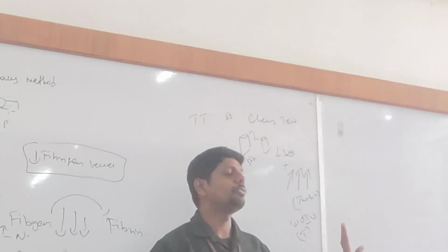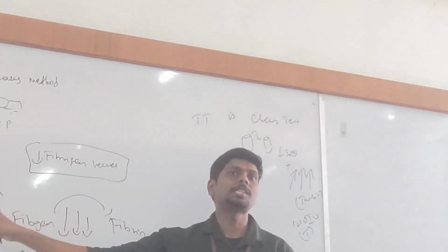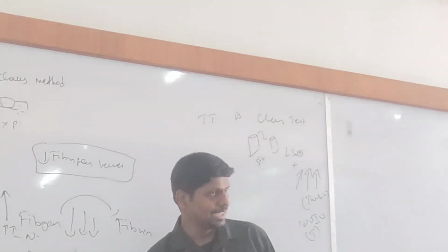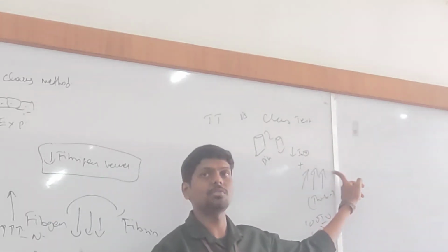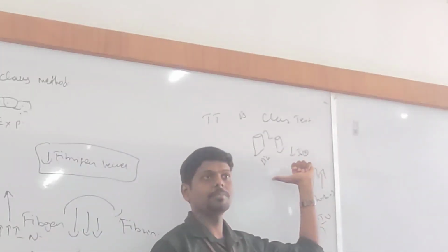Got my point? To increase the sensitivity of this test, I have used a heavy concentration of thrombin. Also, I diluted the sample.